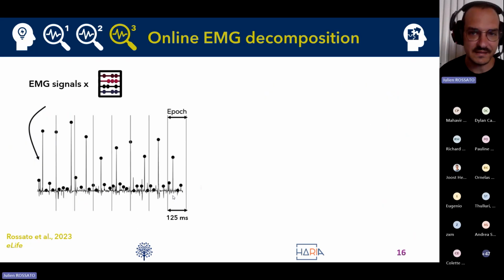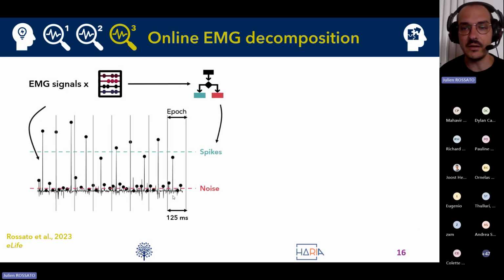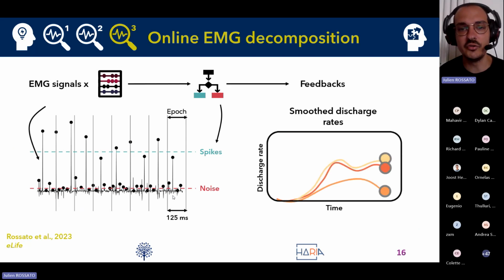During a real-time task, we apply the separation matrix to the EMG signal. So we obtain a source function for each motor unit, and we can identify the local maxima in this function. We then use the classifier to categorize each maximum and identify the instant of discharge. It is then possible to provide online visual feedback on the activity of the identified motor unit.